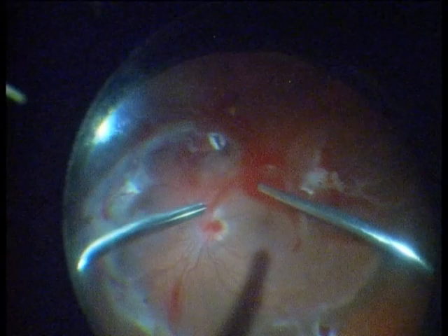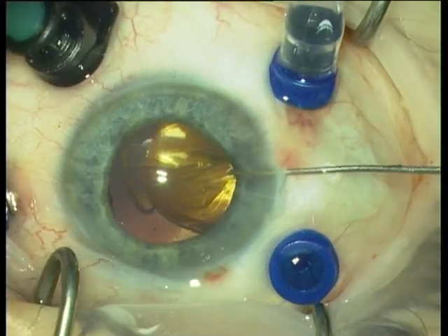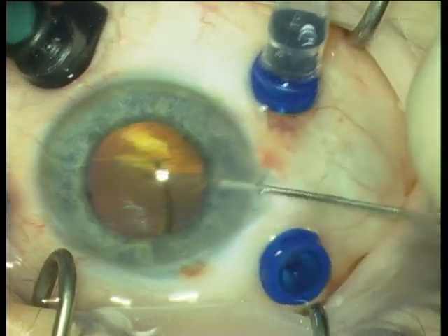You can see the fibrotic ring nasally of the optic disc stretching to the temporal arcades. Following is the removal of epiretinal blood and diathermy. The next step is the injection of PFCL because we have a detached retina nasally, and because we want to perform laser coagulation also in the detached part of the retina. I performed 3,500 laser burns, and implant now the IOL.